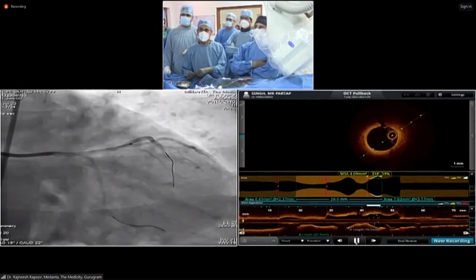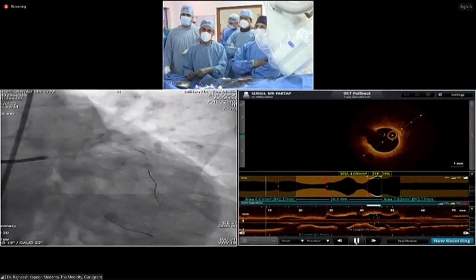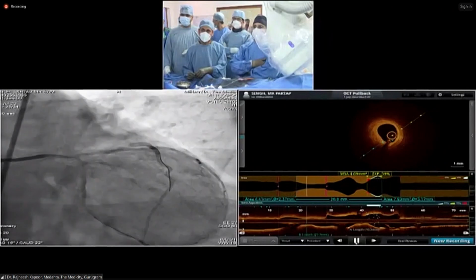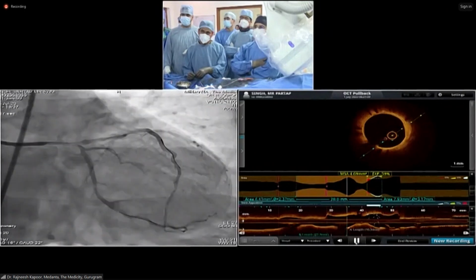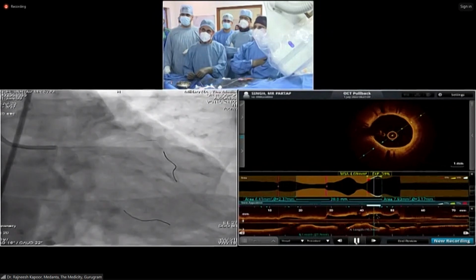So this is a Wolverine cutting balloon from Boston. And this is after the cutting balloon, how it looks. So we have modified the circ ostial lesion with a cutting balloon. Okay, so this is after. Good. Then we have also done the next step.